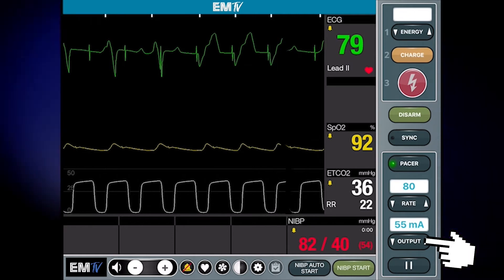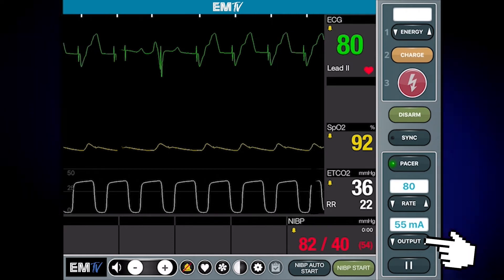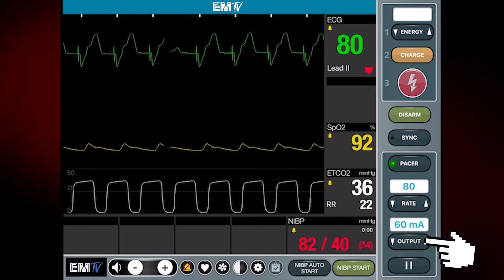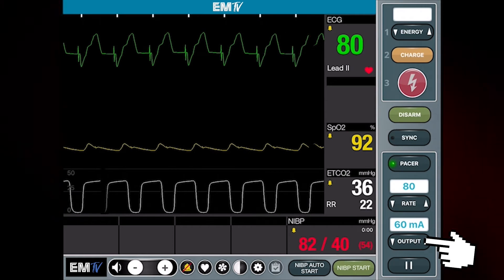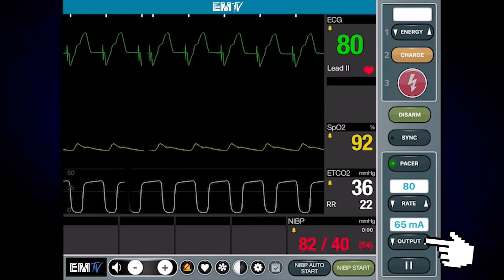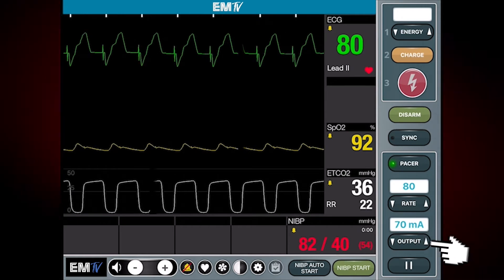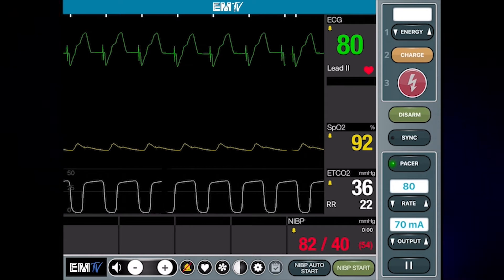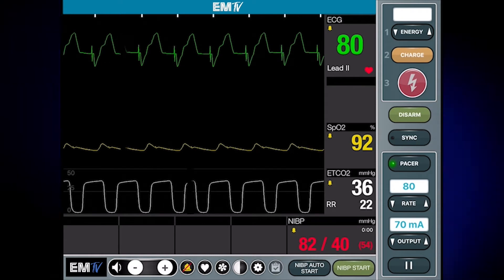I know that pacing is occurring because the pacer spikes are immediately followed by a QRS complex at the same rate which I had set earlier. I will now increase the mA by 10 or 15 more to ensure capture continues during transport.